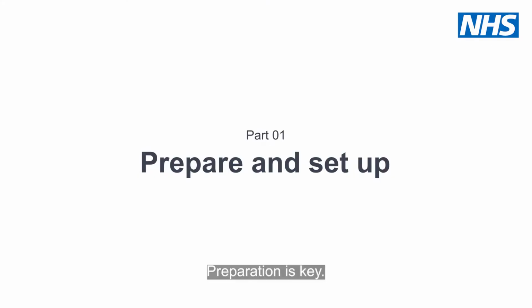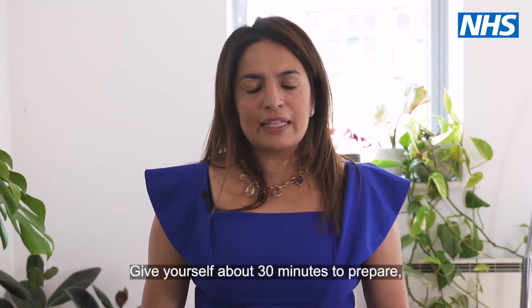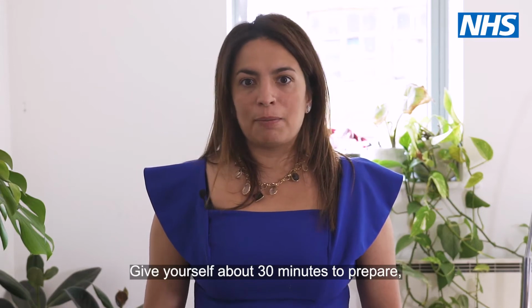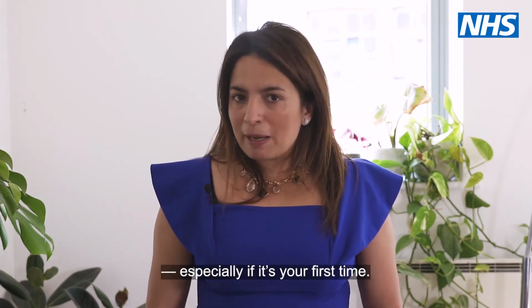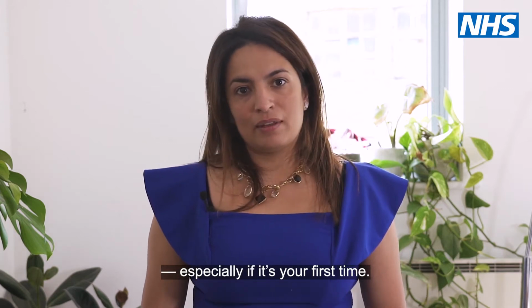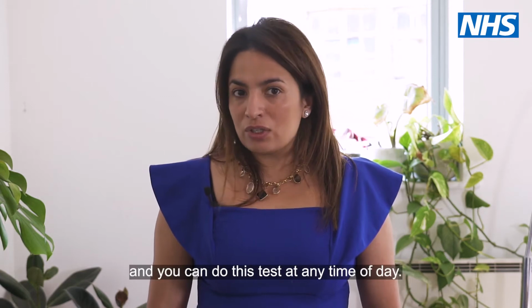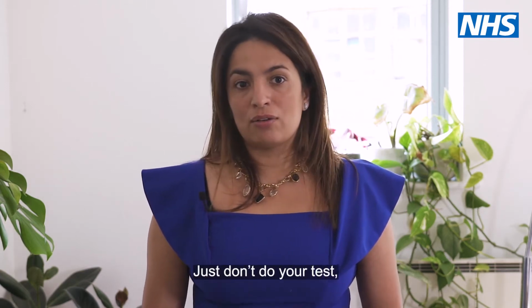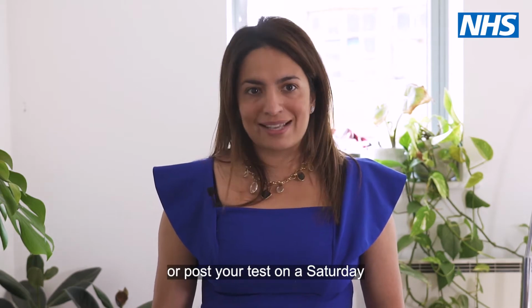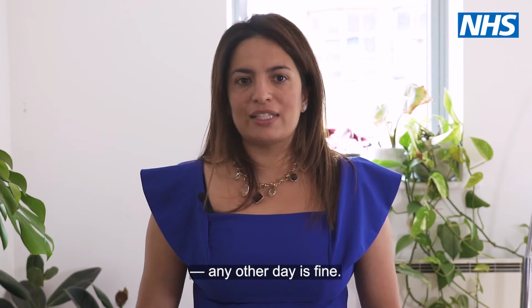Preparation is key. Before starting, make sure that you follow these steps. Give yourself about 30 minutes to prepare, get set up and collect your sample, especially if this is your first time. Unlike some other blood tests, you don't need to fast and you can do this test at any time of day. Just don't do your test or post your test on a Saturday, as it might sit in the post for too long. Any other day is fine.